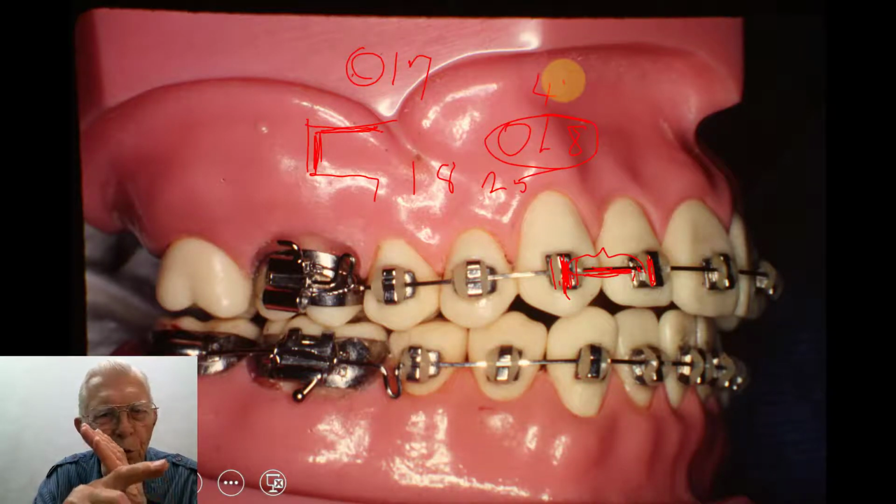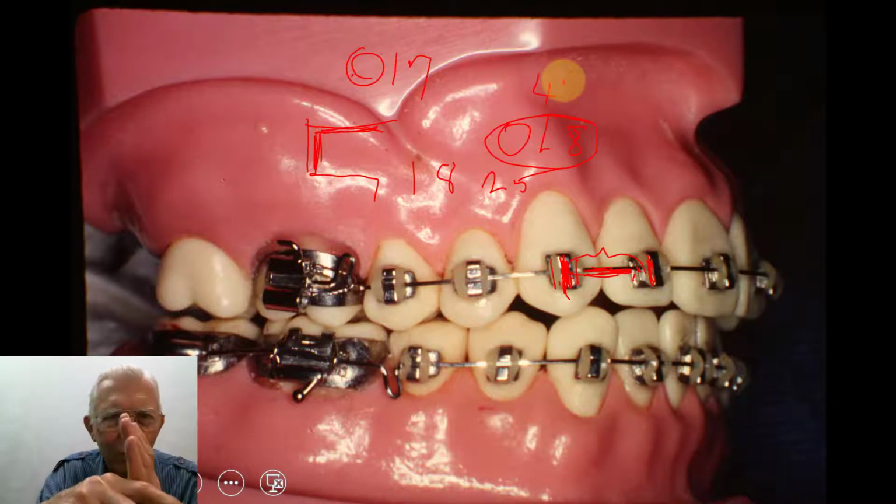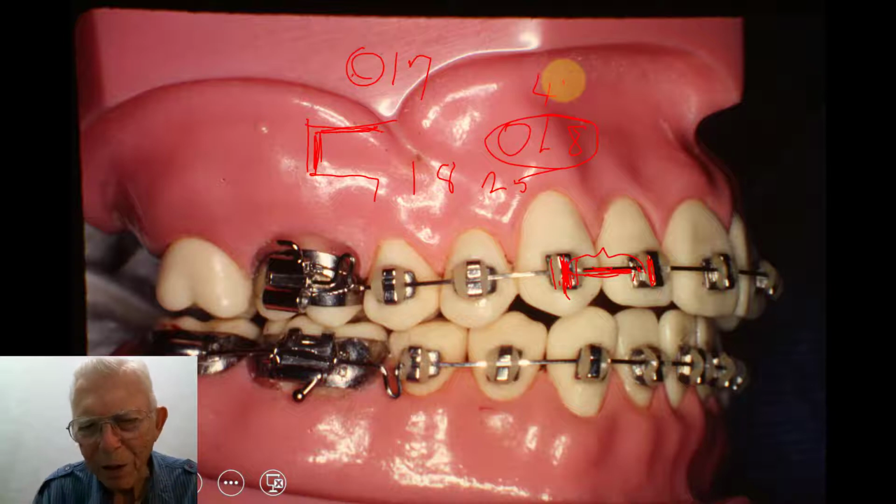And if you took the arch wire and added torque to it, more torque than you'd want, you can move the tooth right there. I had a guy who was head of the orthodontic school here in Texas come up and say it may be torqued so bad you can't get it torqued. That is ridiculous. You can torque a tooth any amount you want to, and at any age. So this idea that you can't move the teeth after a certain age is ridiculous. I don't want to get into that argument.